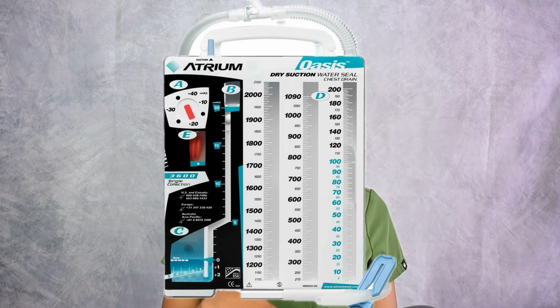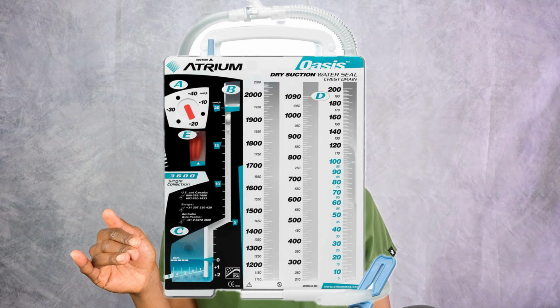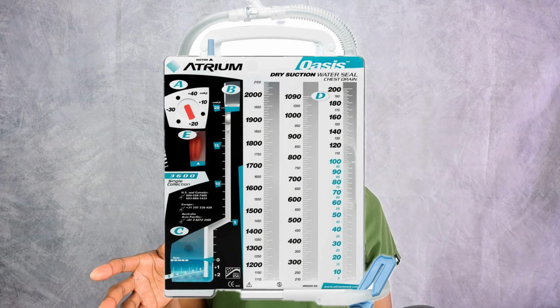Mark the level on your chest tube system at least once per shift, possibly every 4 to 8 hours. If the output exceeds 100 milliliters per hour, or the color changes, you want to inform your provider. So we have the wet suction system and we have the dry suction system. The dry suction system has a dial. You remember it as D for dry, D for dial. You shouldn't see any bubbling at all in the dry system, but in the wet system, it's okay to see some bubbling.